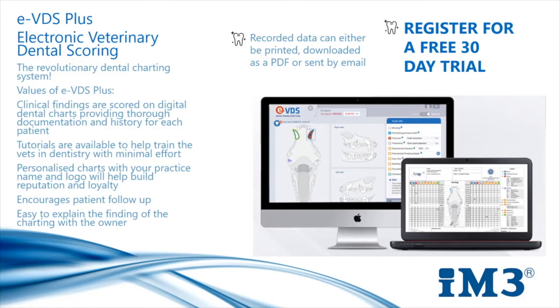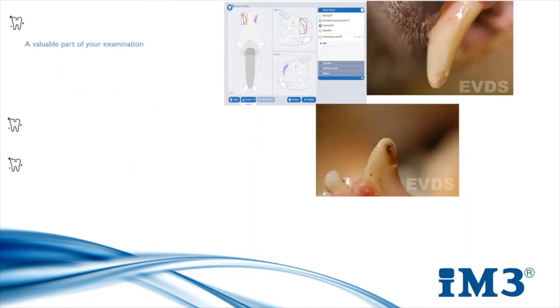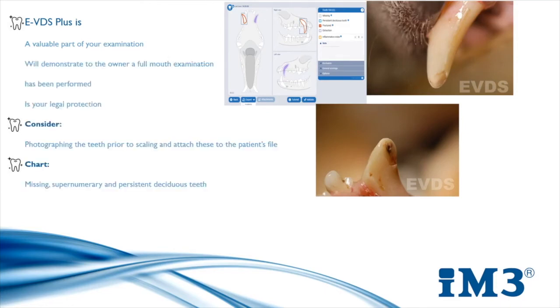So just to reiterate, charting is a valuable part of your examination, and it's also going to demonstrate to the owner that a full mouth examination has been performed. Most importantly, it's also your legal document. You need to also perhaps consider taking a picture of the patient's mouth prior to any scaling, and then you can attach these to the patient's file.